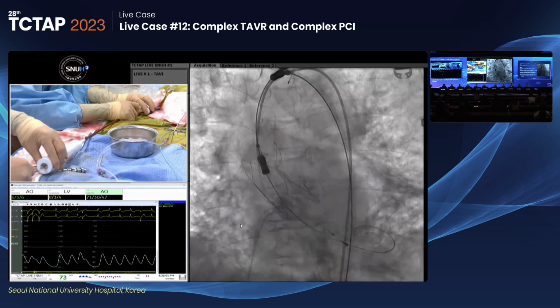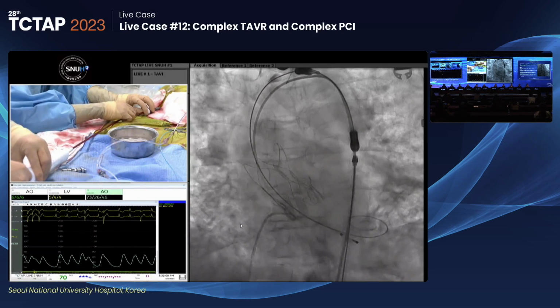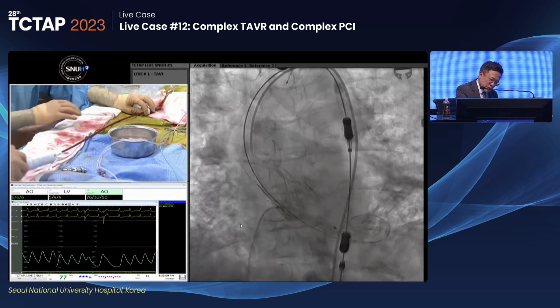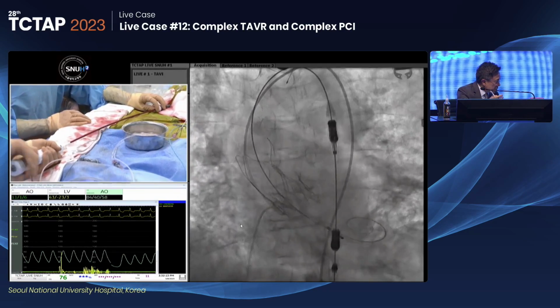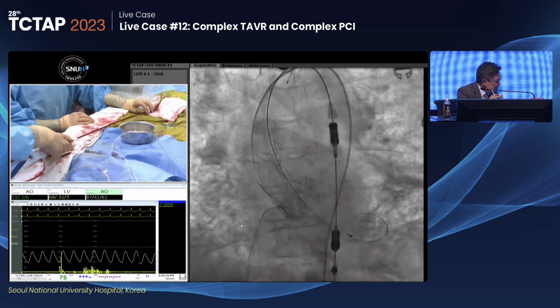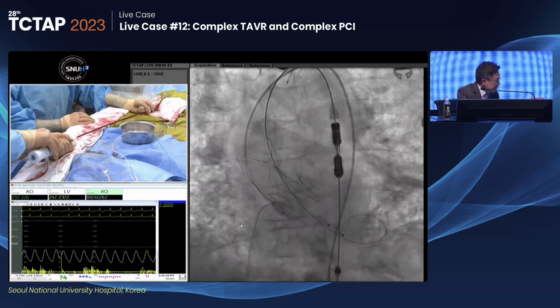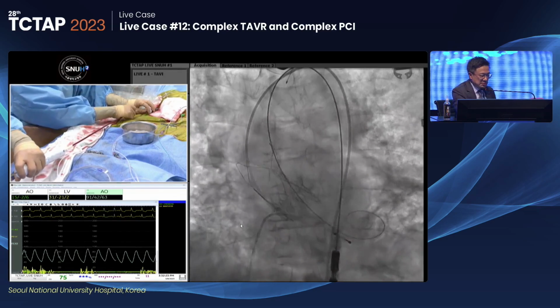Eberhard, we have discussed early on in the lunch symposium about LVOT calcium, valve calcium, and also STJ calcium. For this type of valve, the stabilization arch is relatively soft. So even with LVOT calcification, STJ calcification seems to be okay because you're basically just holding it, but not exerting a lot of force. Is that fair? Yeah, that's fair.